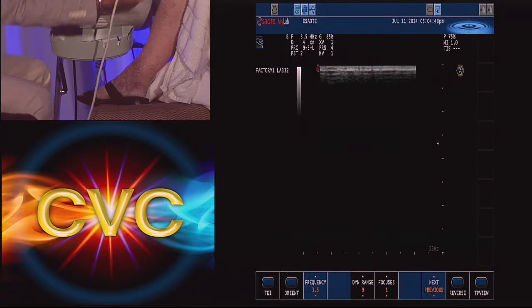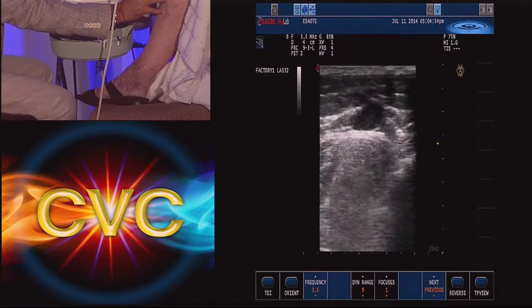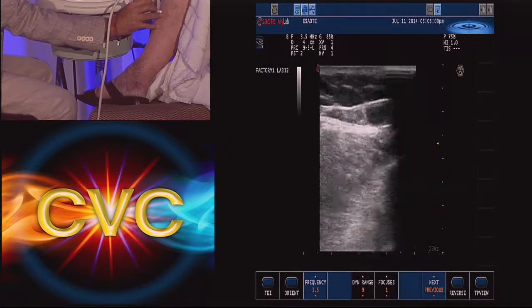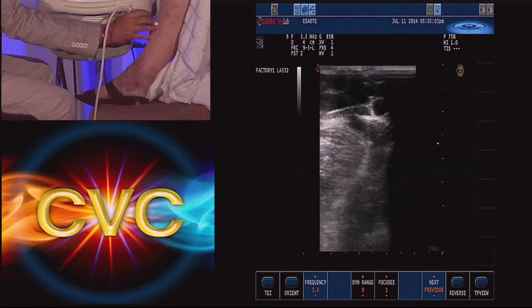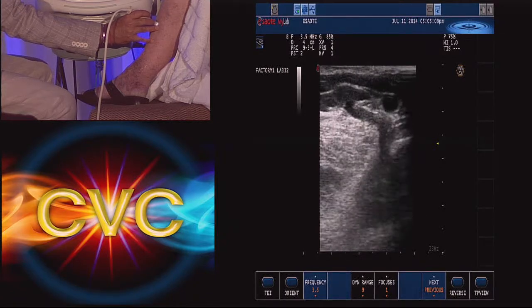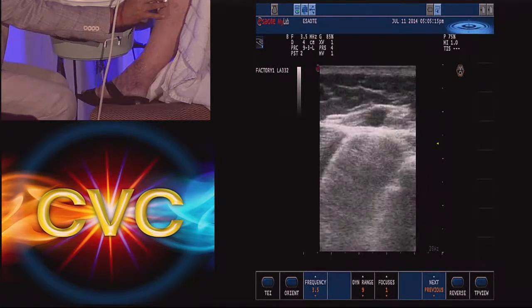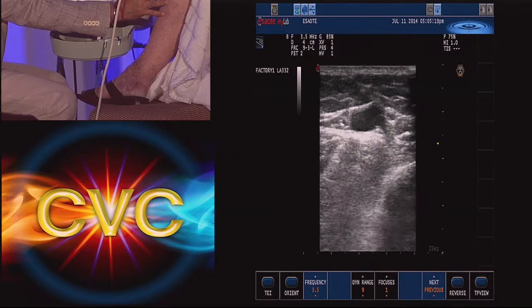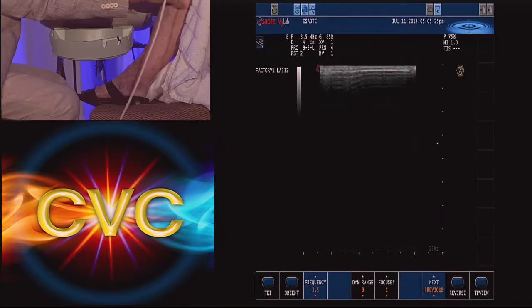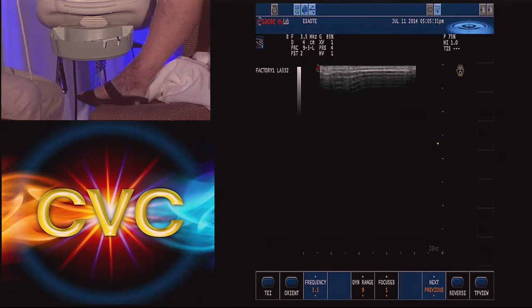So in this case, if I look at her saphenous, she's got some reflux, and you can see it's large. I'm coming down. So I know that the saphenous reflux is contributing, and there's a perf re-entry right here. So we know that her saphenous below is also incompetent, and there you see how it jumped out and there's another branch feeding, and I can see some changes here. So actually, we draw a diagram of the saphenous and draw what part is incompetent, what's not.